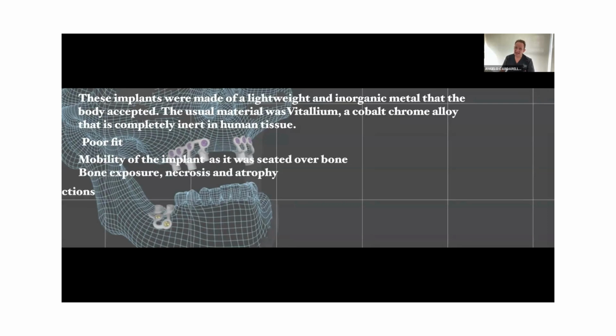In the past, another problem was related to the stability, because in the previous customized implants type, it was not included the screw to fix and to stabilize the customized implant. But as you know, if we have some micro movement, we will lose the stability and we will lose also the bone.